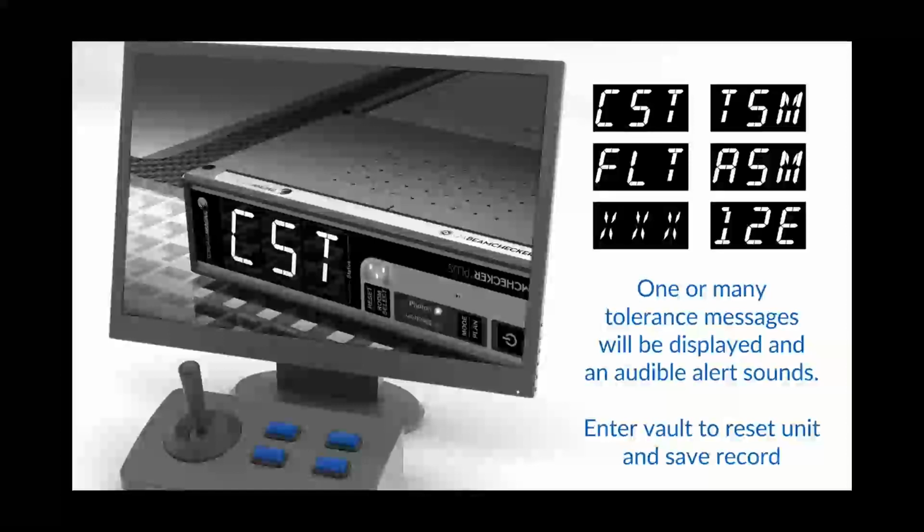That's the only time you need to enter back into the room, is to reset the device, just to indicate that you have addressed the issue, and it might have been an alignment issue. You have to just deliver it again, or it may be something that needs a little more involvement and detective work to figure out why your machine is not performing correctly. But you do get those indicators, those notifications saying, hey, something's not quite right.